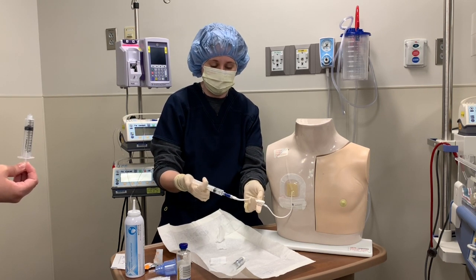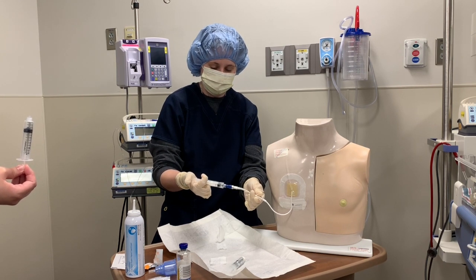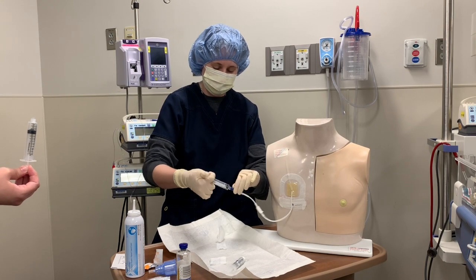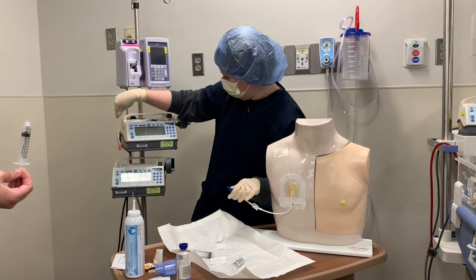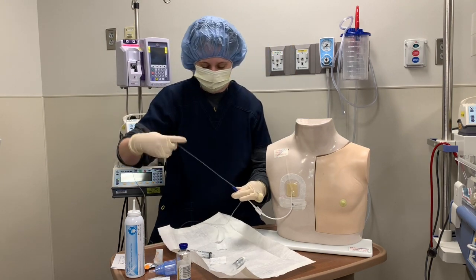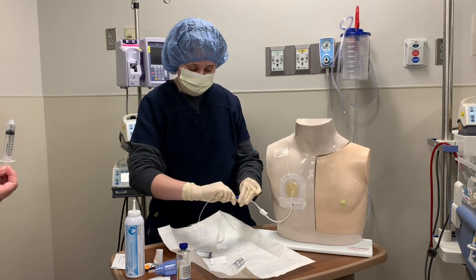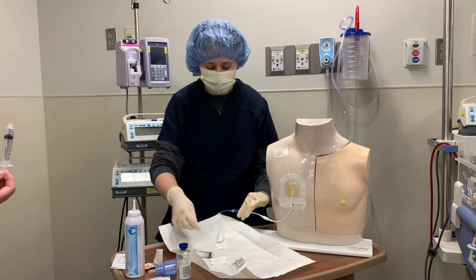As I'm pushing in the last little bit, I'm going to clamp it. I'm doing a pulsatile flow and then clamping on the last little bit. Then I would either reconnect or put a green keros cap on it. I need to go into Cerner and document my needless adapter change and, if I did any tubing change, that as well — so we know when they're due to be changed again.